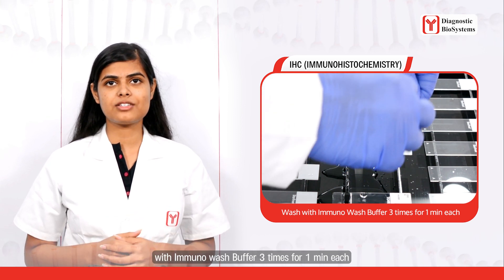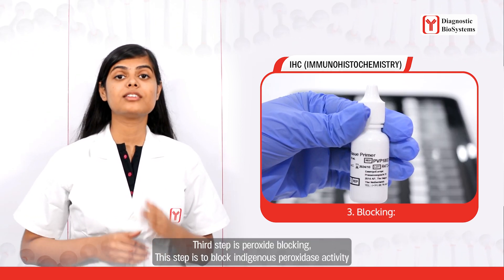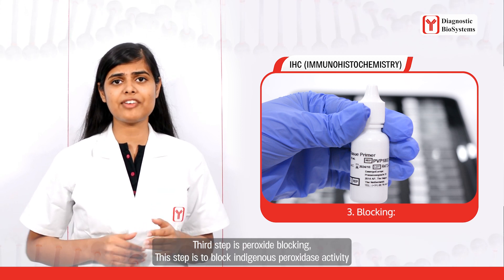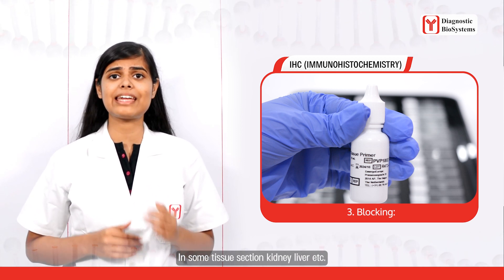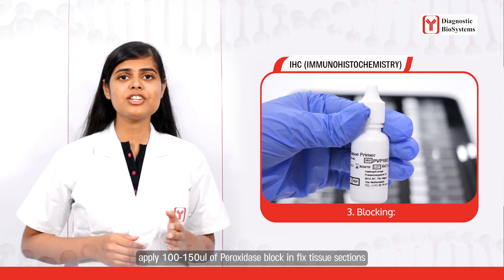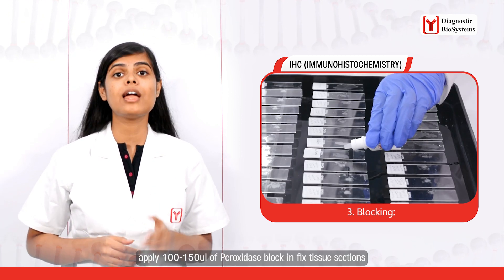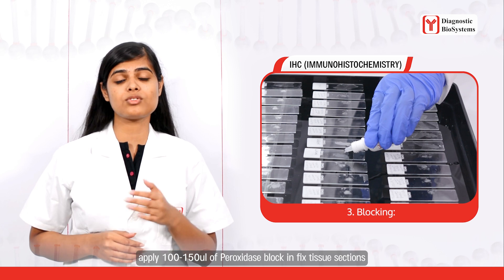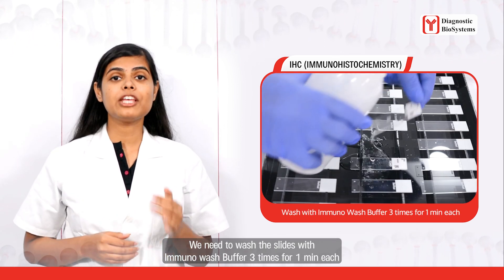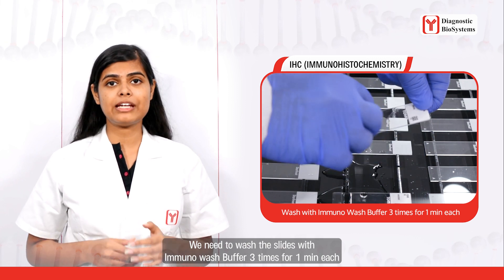The third step is peroxidase block. This step blocks endogenous peroxidase activity in some tissue sections like kidney and liver. Apply 100 to 150 microliters of peroxidase block to the fixed tissue sections, then wash the slides with immunowash buffer three times, one minute each.